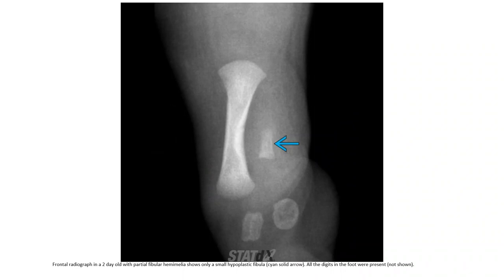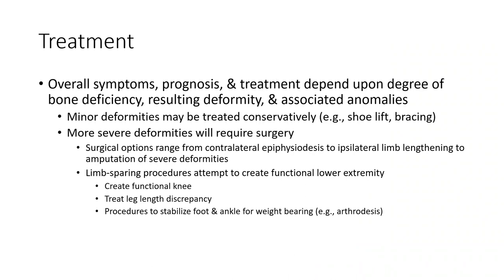Frontal radiograph of a 2-day-old with partial fibula hemimelia. Only a small hypoplastic fibula is present, along with findings in the foot.